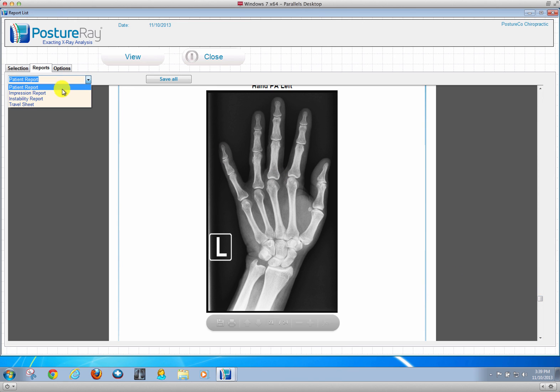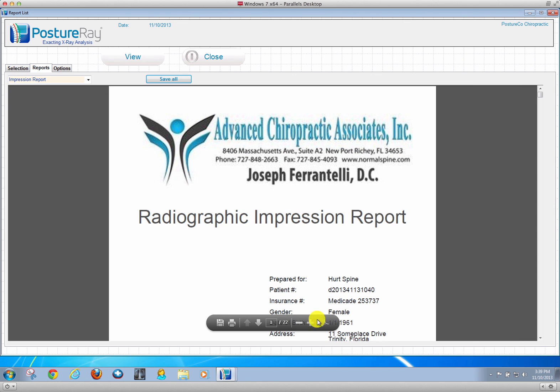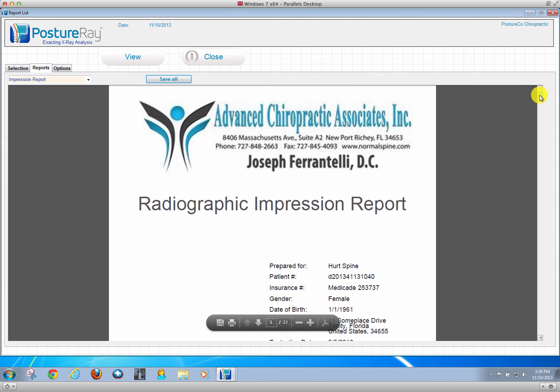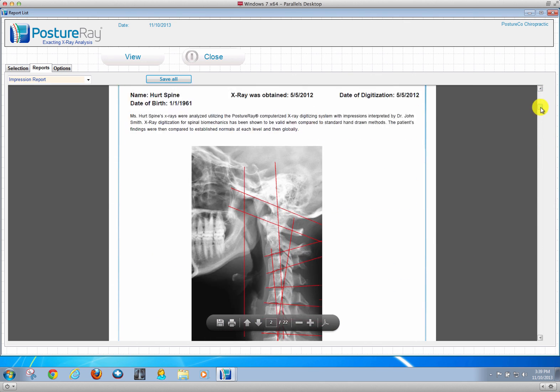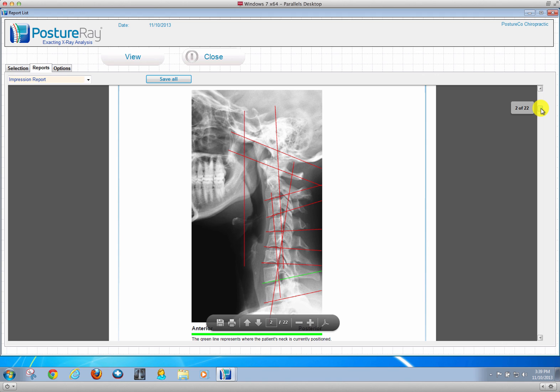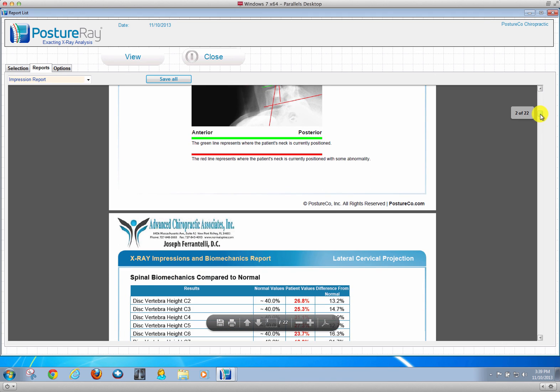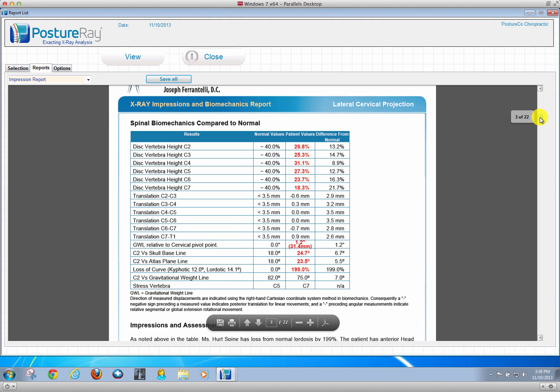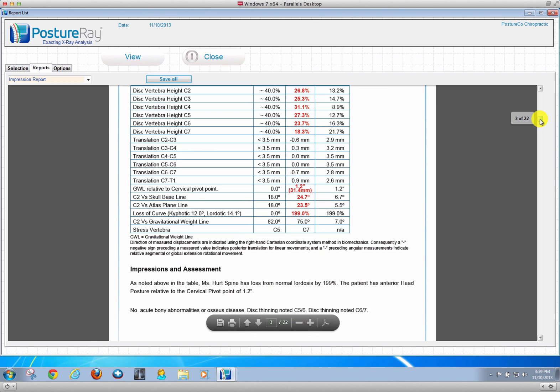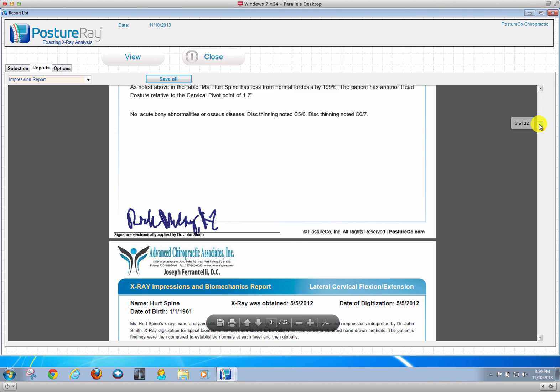The clinical documentation would be the impression report. Just like our other versions of PostureRay, this would be the doctor's notes. It would show, for instance, the lateral cervical. If we look at the lateral cervical, it will show all the displacements that are Clear technique specific.